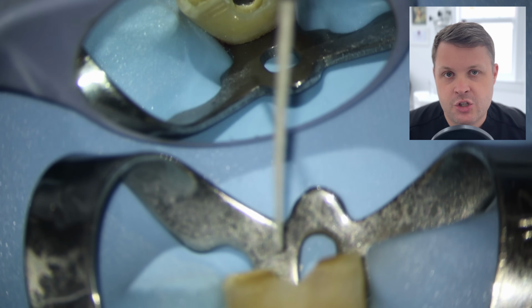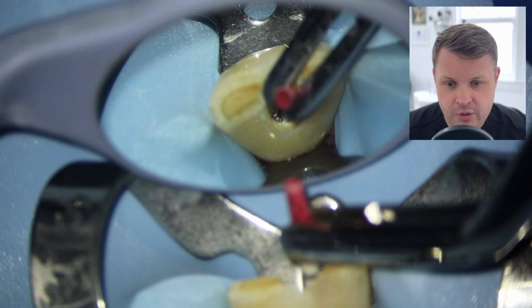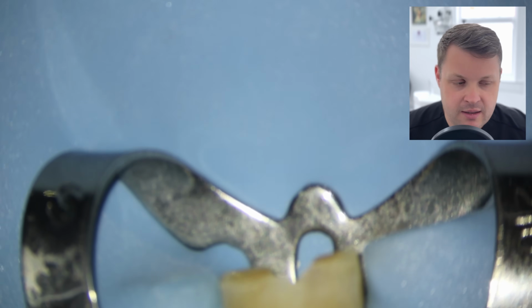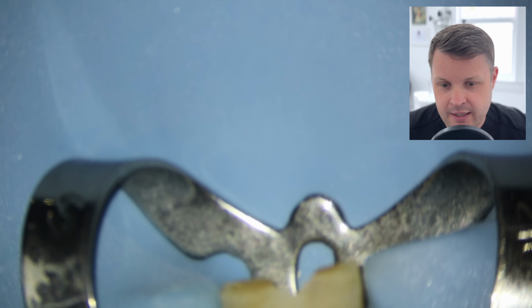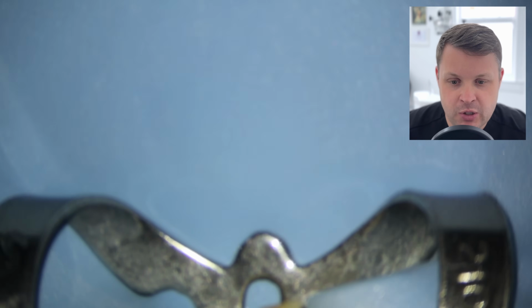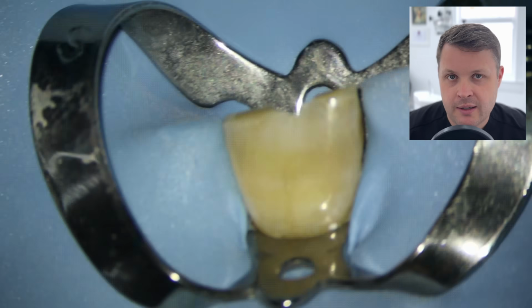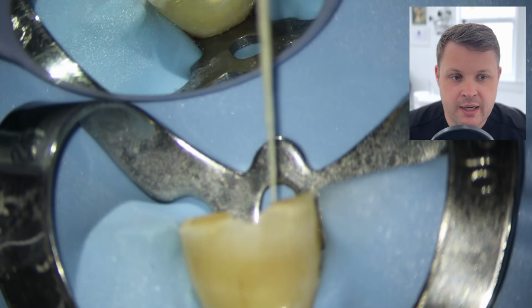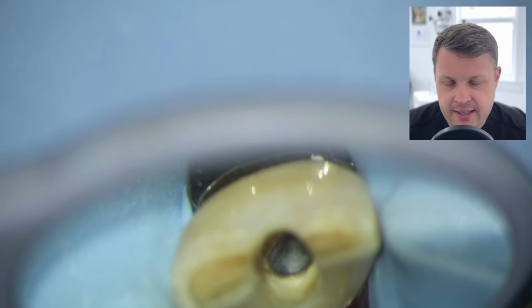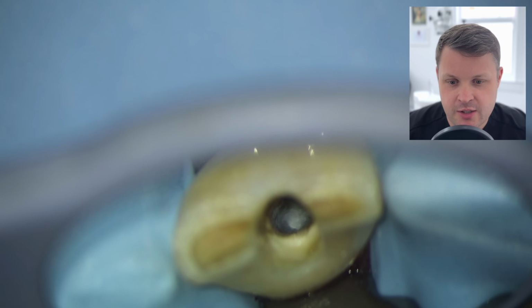And once we've dampened everything down and we've had a little look, we can see now that this perforation's quite nice. So we're going to do our final drying protocol in the main canal. We're going to make sure we dry this. I think the tooth has been quite badly closed up, so there's been a significant amount of inflammation that's built up with this tooth, and this is why it's taken quite a long time to dry this canal. And when we look now, we can see that the canal space is nice and dry and everything's looking great.